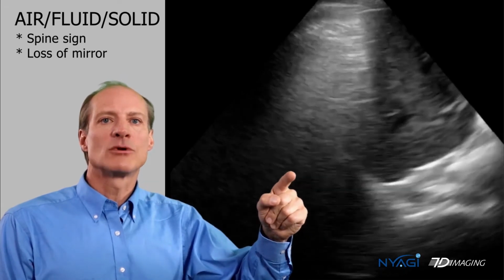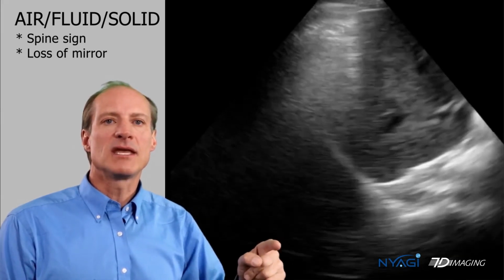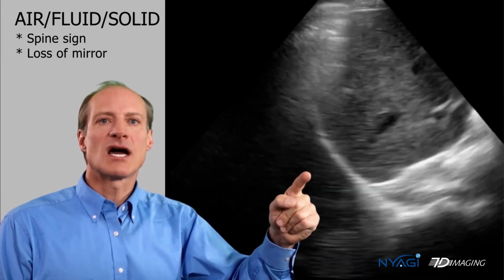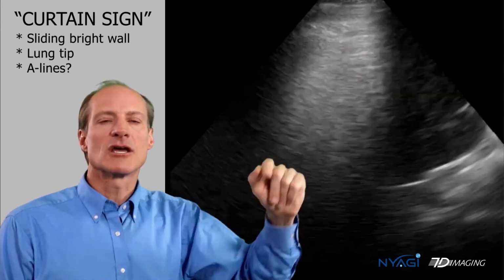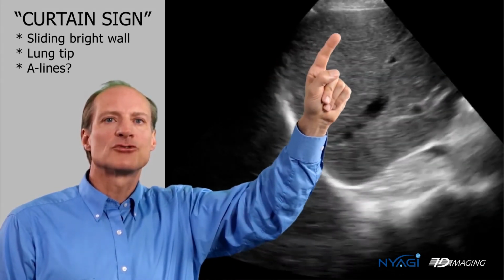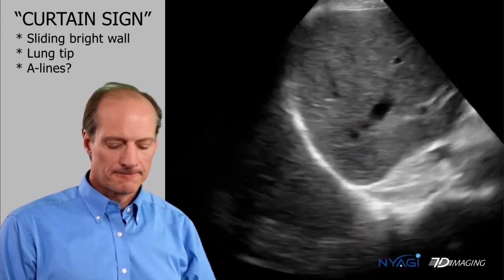Using the mirror artifact will confirm air in the bottom of the lung. If you see the spine reflection extending above the diaphragm, it means that there's something reflecting the sound waves above the diaphragm, which would either be fluid or solid. Also notice that you've got what's called a curtain sign in this video. You can see the aerated lung sliding across the probe face, blocking the sound waves from transmitting because, again, sound waves don't travel well in air. They travel well in fluid.